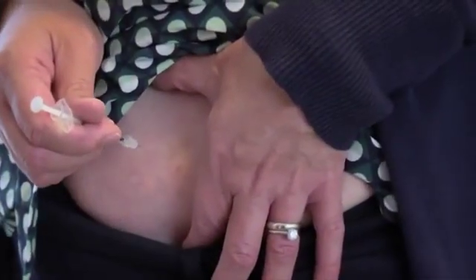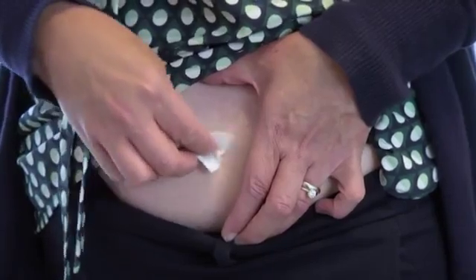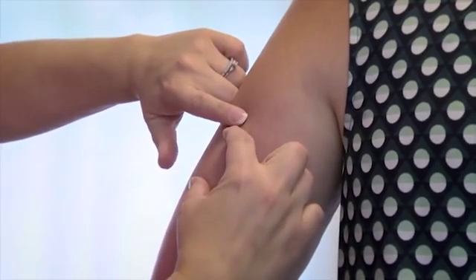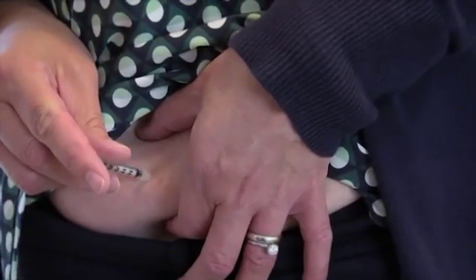The injection site is about 2 inches of skin. Clean this area in a circular motion with an alcohol wipe. Move the site of each injection. Inject at least 1.5 inches away from the last spot where you injected. Try to inject in the same general area of your body at the same time each day.